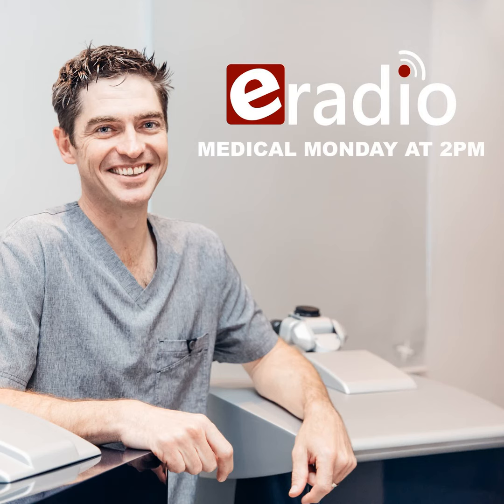And then also, when you're doing the laser, with the excimer laser, you're removing more scaffolding. So we've got to look at it and say, well, once we've done your laser, what does the safety of your cornea look like? And if we decide, no, creating a flap is going to potentially weaken it a little bit too much, then we consider what we call Streamlight, or a trans-epithelial PRK, so the laser doing the whole procedure itself, or a PRK.